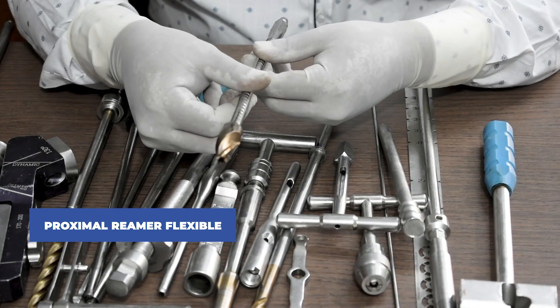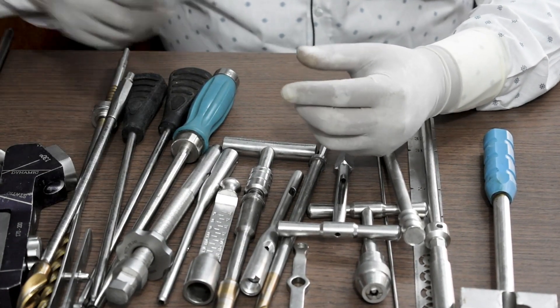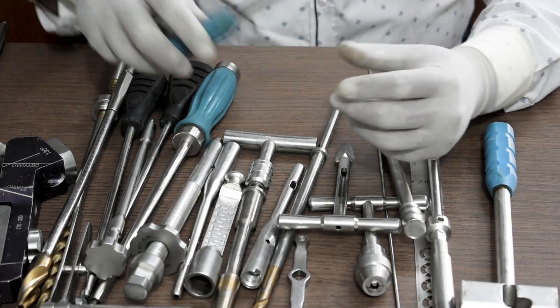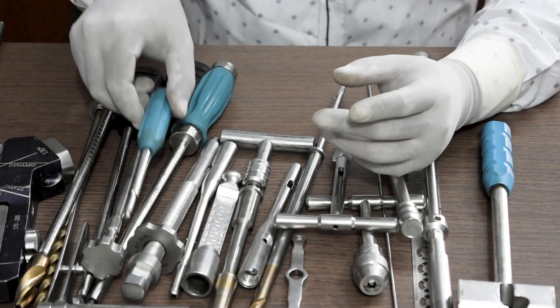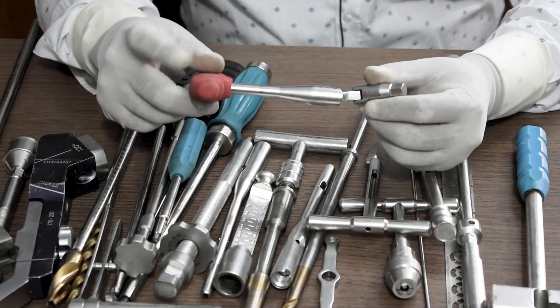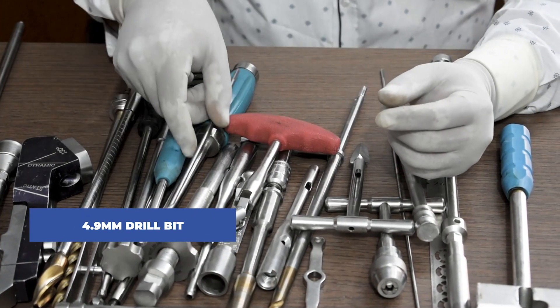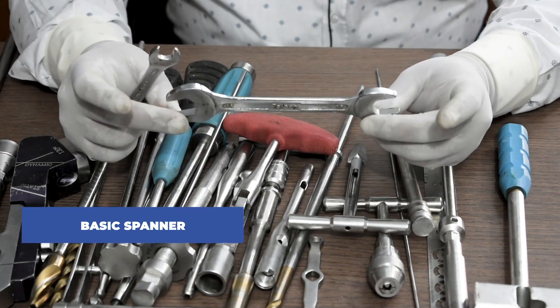This is a flexible proximal reamer. This is the screwdriver to adjust the blade. This is a box spanner to tighten the buttress nut. This is a drill bit for the 4.9mm locking bolt. This is a basic spanner and can be used for several purposes during the surgery.